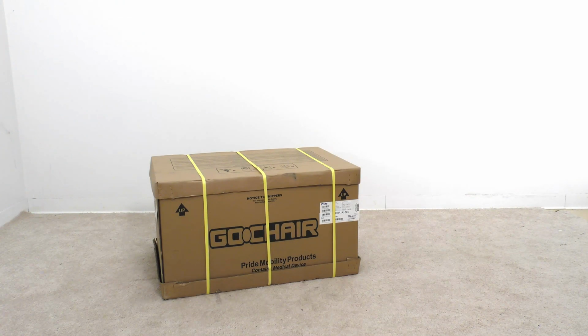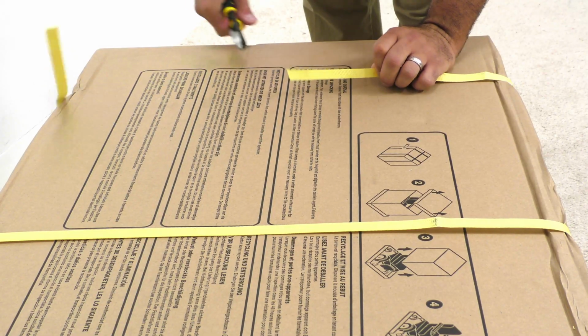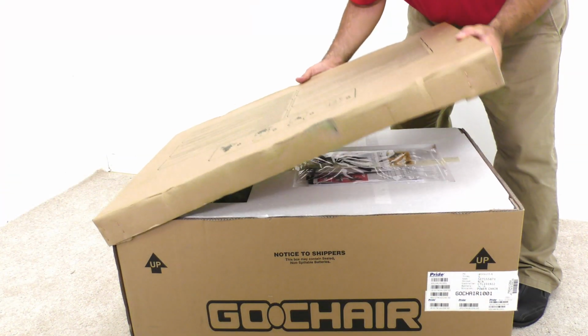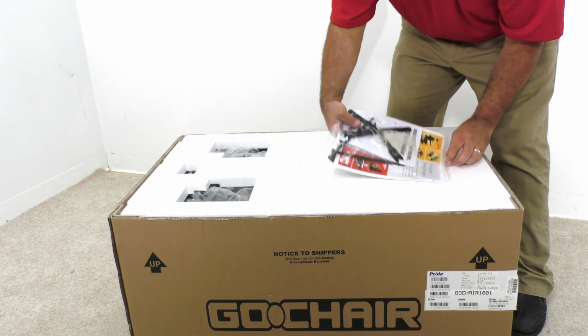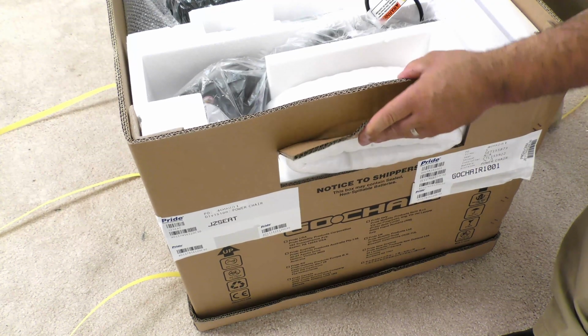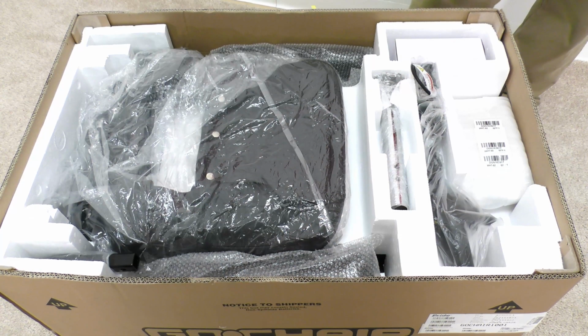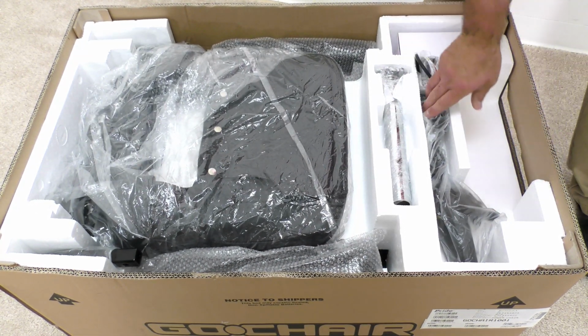When your Go chair arrives, it will be contained in one box. Cut the banding using a pair of cutters and remove the box lid. You will find the owner's packet and quick start guide on the top of the packaging. Please note the Go chair shrouding is added to the carton before it ships through a slot on the side of the box. They are wrapped in white packaging and labeled, and it will be in a styrofoam compartment.